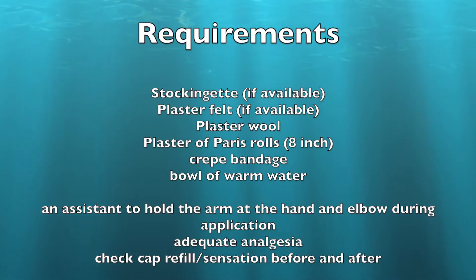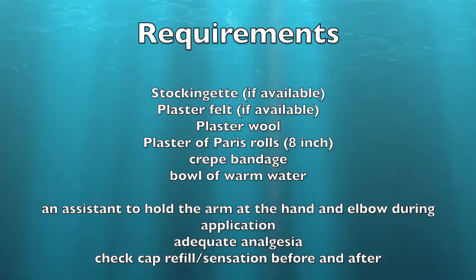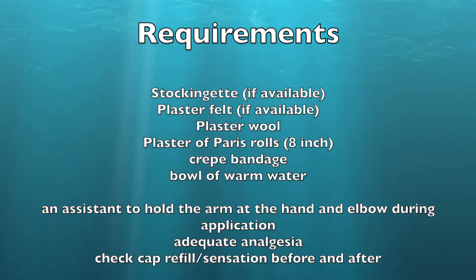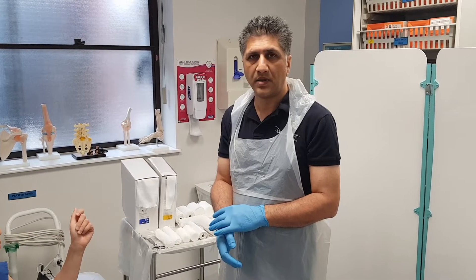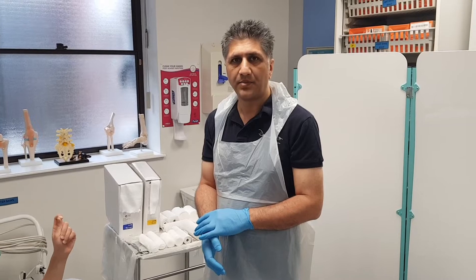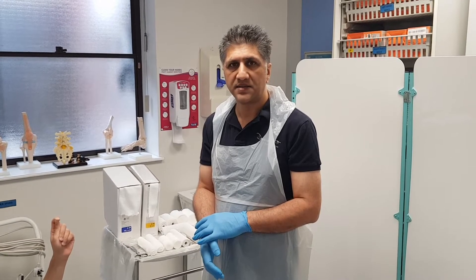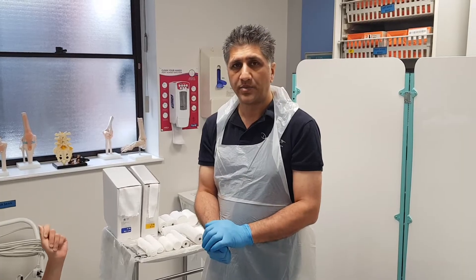It's helpful to have an assistant to hold the hand so that you can keep the elbow at 90 degrees during the application of the plaster. As the radius is the larger bone in the forearm, especially more distally, we're going to apply the back slab more on the radial side distally, but it needs to go around the back of the elbow more proximally.